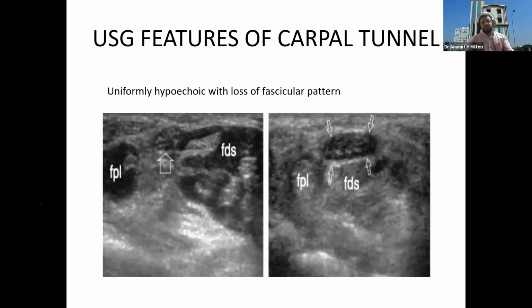Okay, so here we can see a very small, uniform median nerve, but here is the swollen median nerve. If we compare the right and left hand, we can measure these things very clearly. If there are no symptoms in the left hand, this is the smaller one. If there are symptoms on the right side, it is the bigger one. So you can just compare these two very easily.